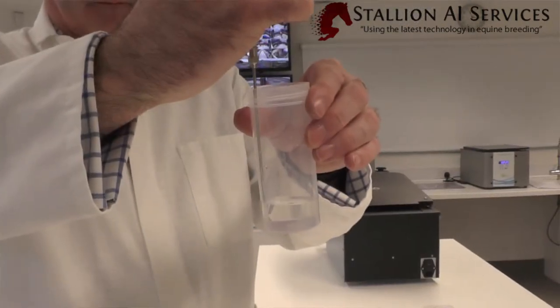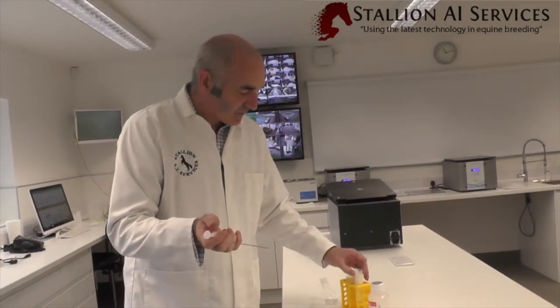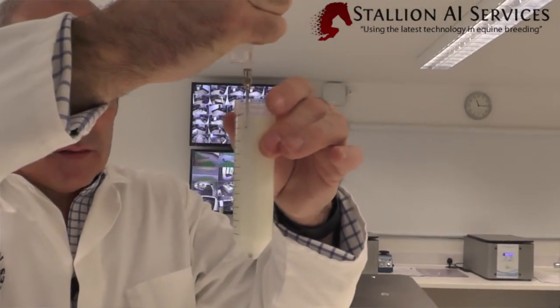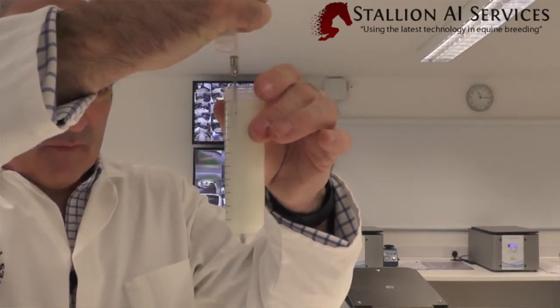We want to make sure we get rid of the air when we first suck it up. Then with our semen sample we go down to the bottom and very slowly push it up, pushing our two mils in. And this is our cushion, as you can see here.